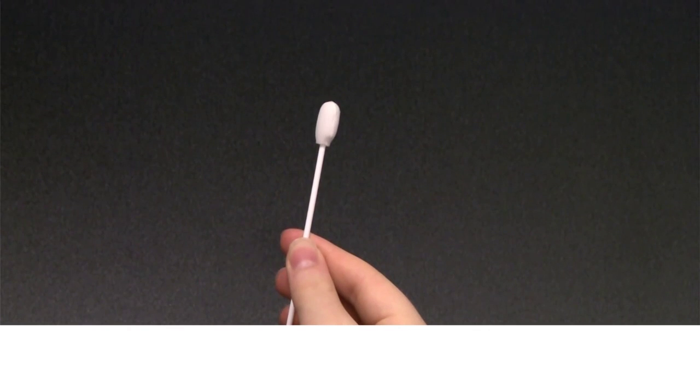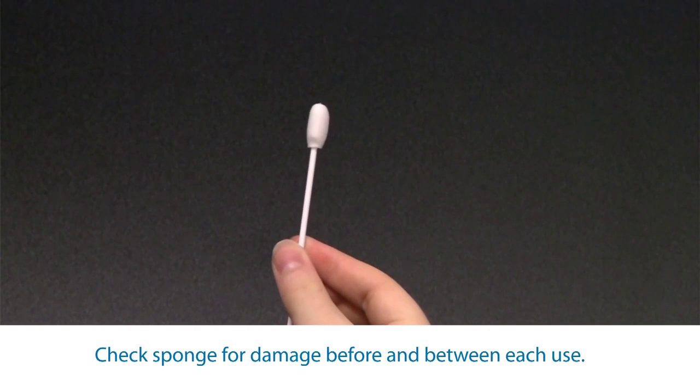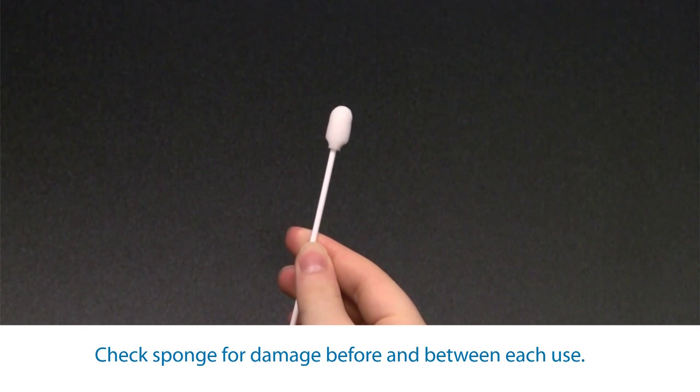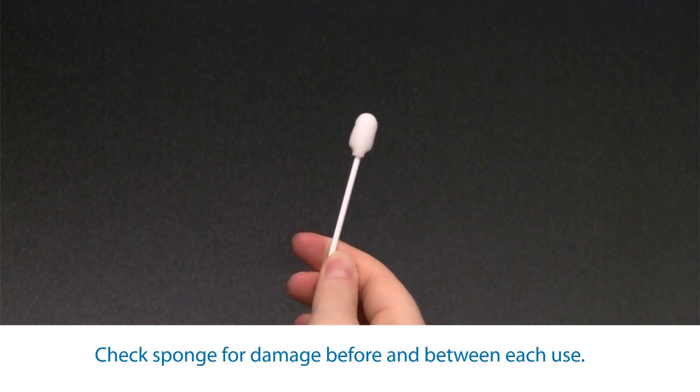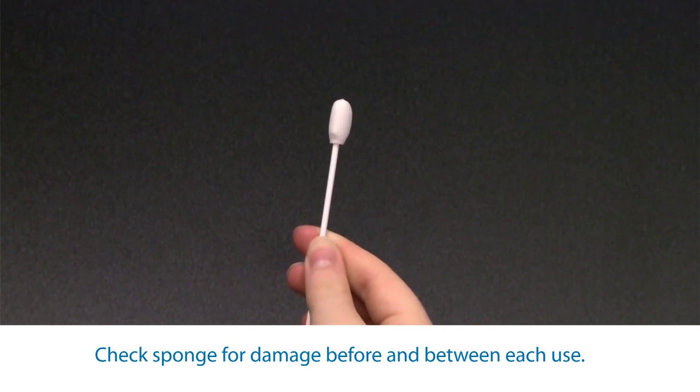Check the sponge for damage before and between each collection. Use the second sponge provided as backup if the first sponge shows any signs of wear or tear, but do not substitute with any other sponge or swabs.